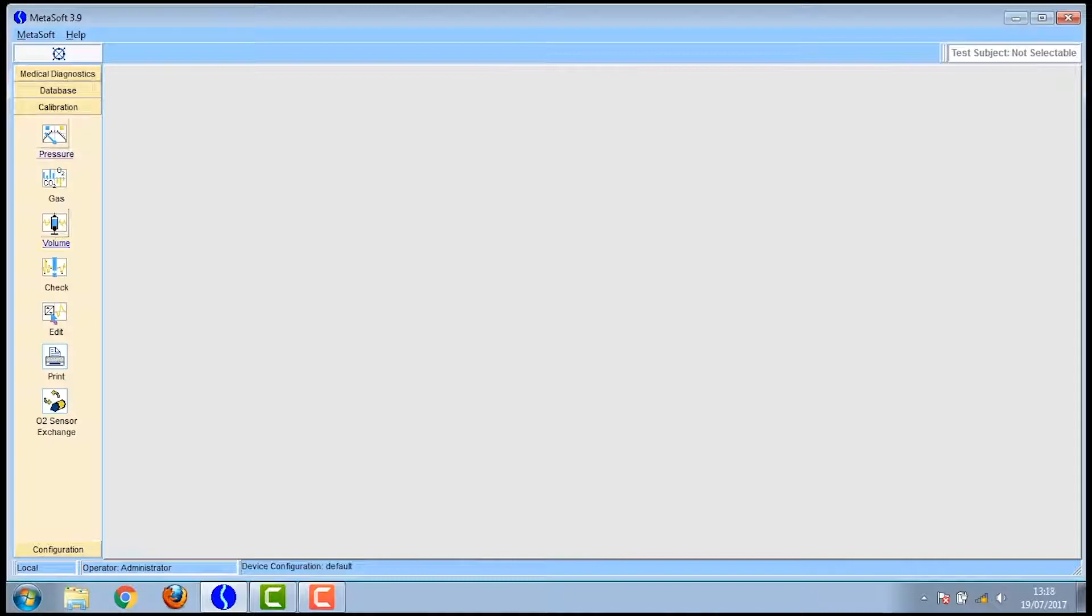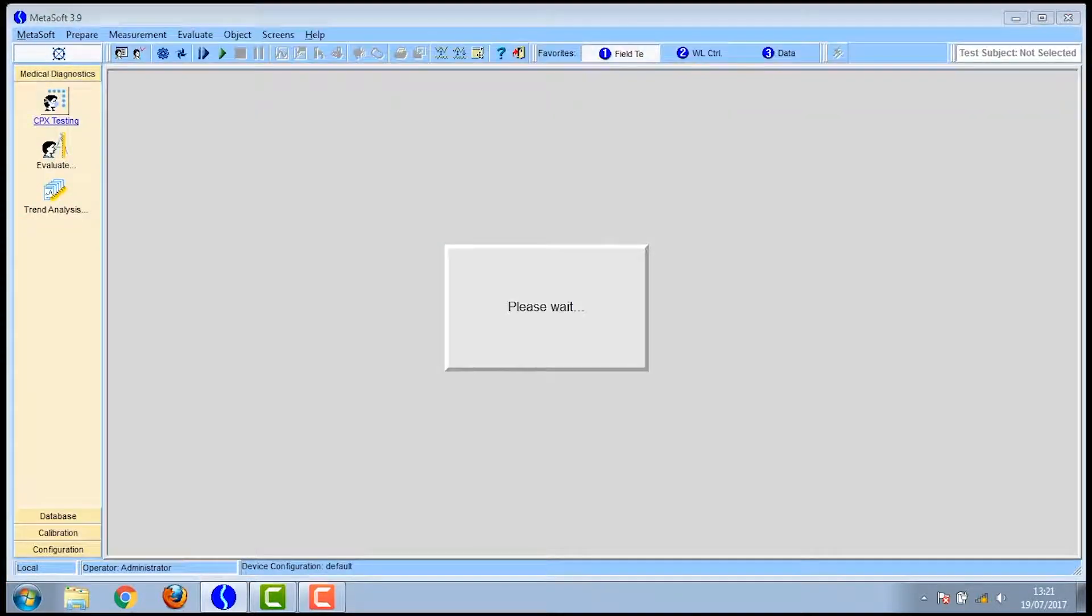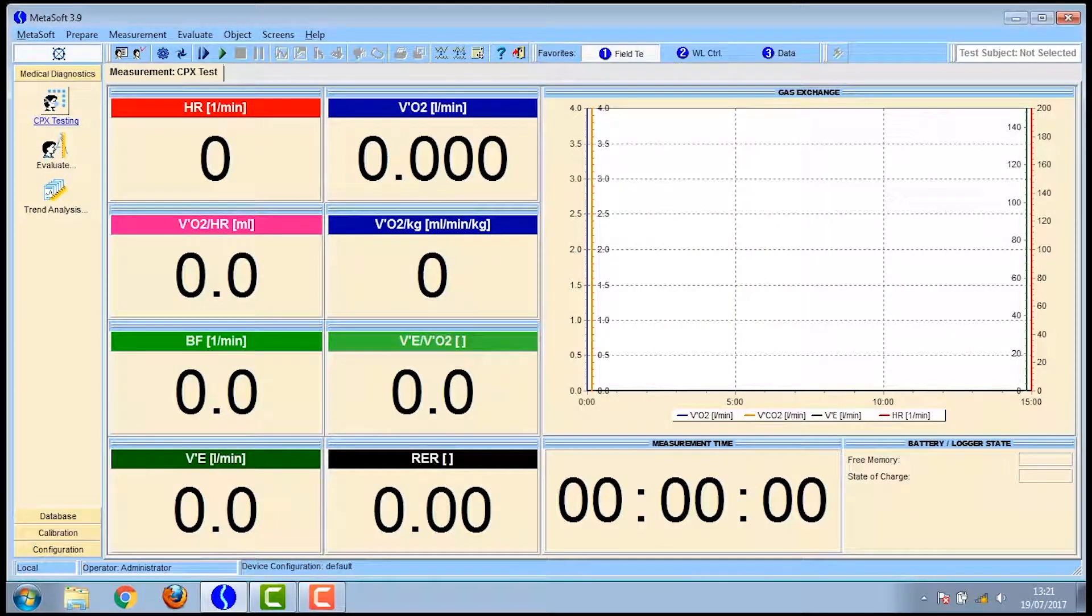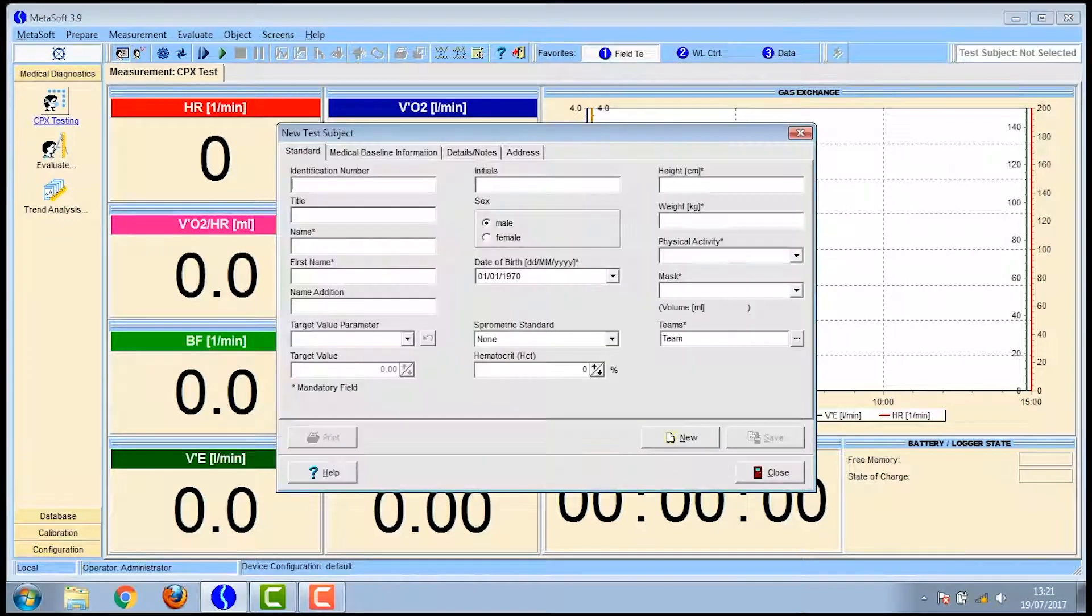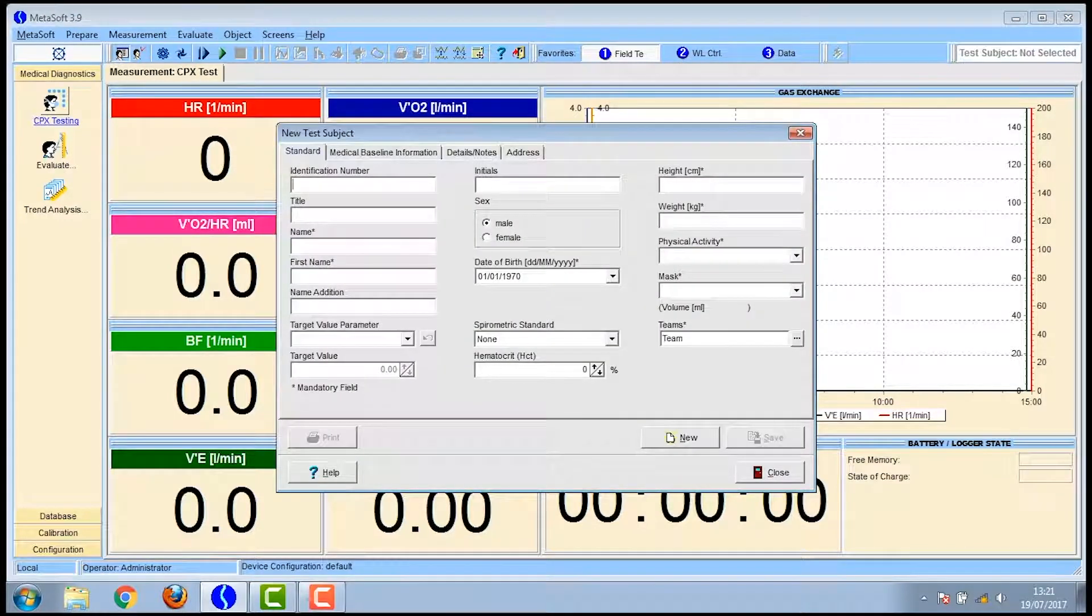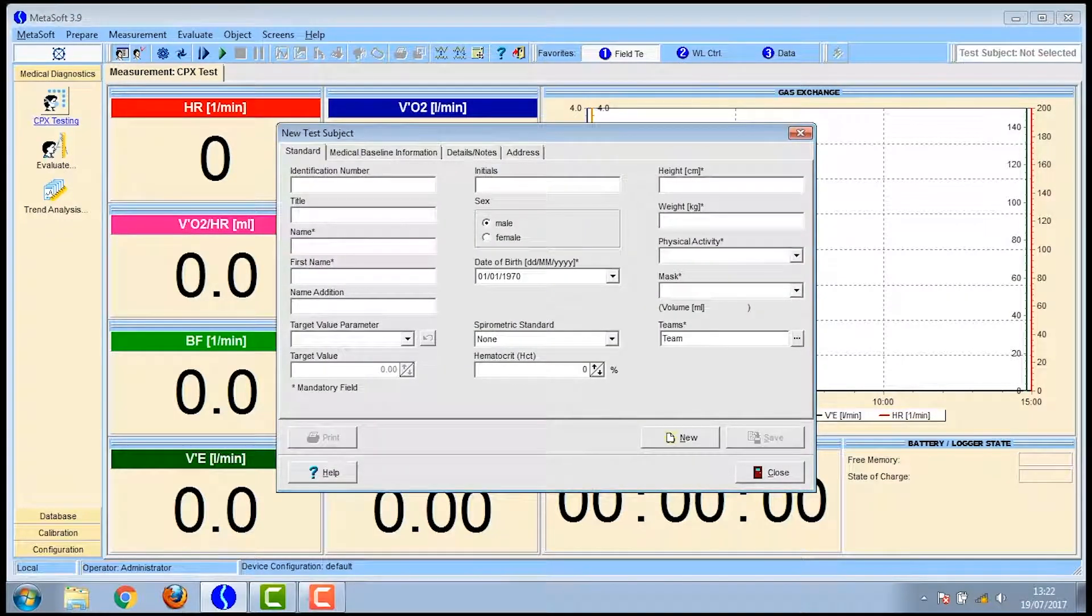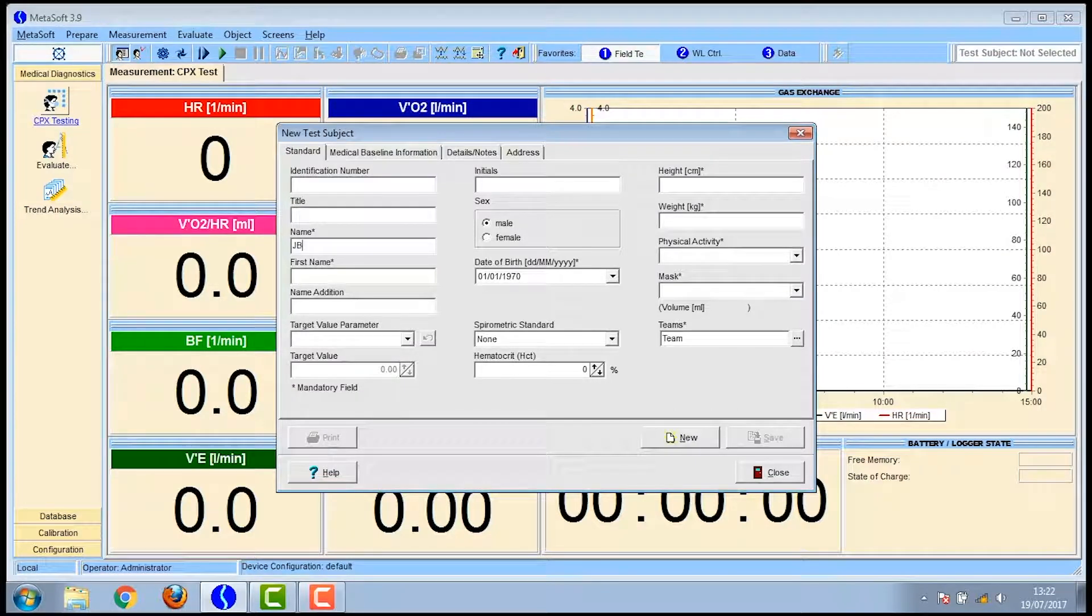Now you're ready to set up the test for your participant. You click on the CPX testing on the left hand menu and the next screen appears. Then you click on the box at the top left which shows a picture of a person with a screen behind it. This is for a new test subject.